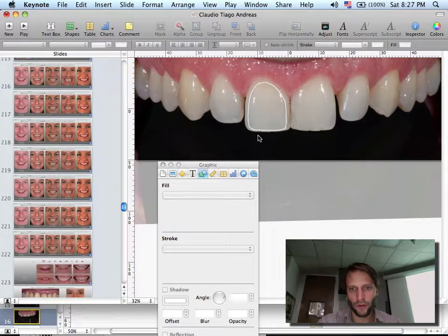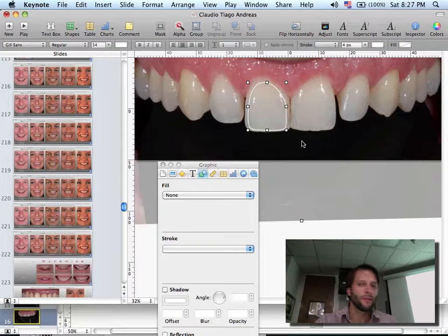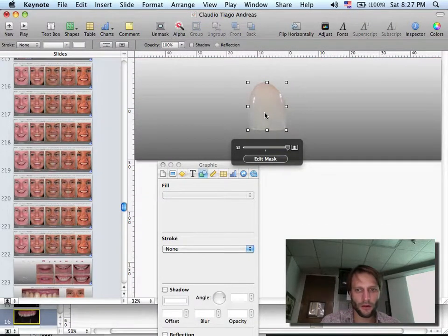Okay. So when I do this, I draw on top of a picture. I select the drawing and I select together the picture. That means you hold command, which means you can select more than one thing. On PC you use control. So if you hold control and you start clicking on things, you start selecting all of them. On Mac it's command. So I hold command and I click on the drawing and on the picture. So both are selected. You see there's a square here and a square there. And then I just mask. Very simple. Once I mask, I have this floating veneer.